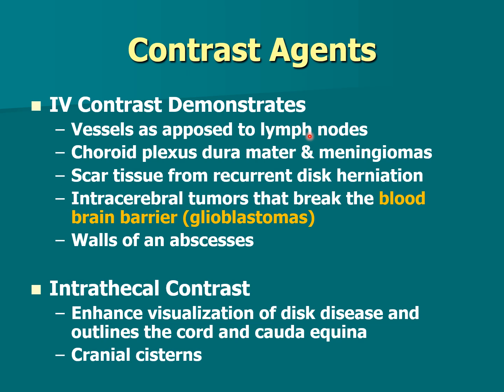if we're doing it in the neck, especially, there's lymph nodes in the neck, and sometimes the lymph node can look like a vessel. If we give IV contrast, then it's going to light up the arteries, and we will know that's not a lymph node.